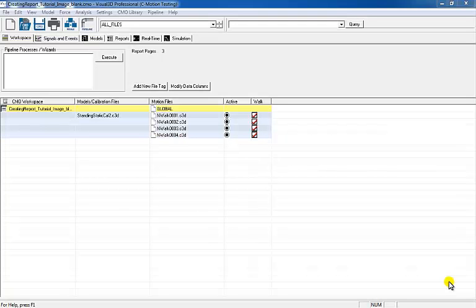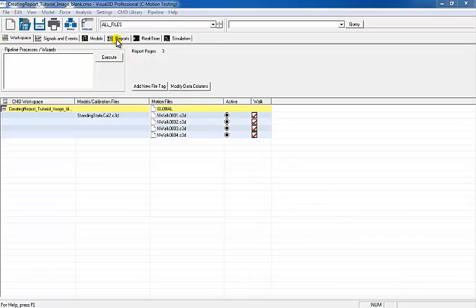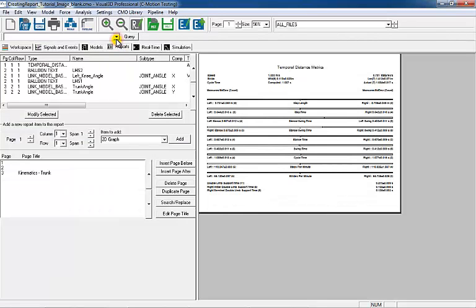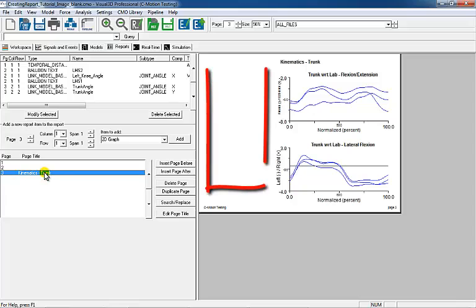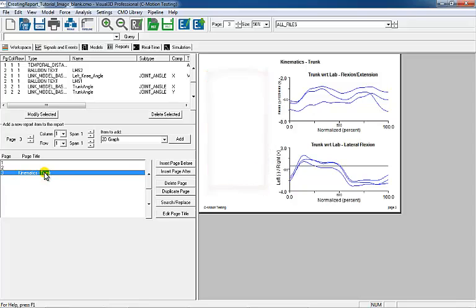By opening the Creating Report Tutorials CMO file, it can be seen that some items have already been added to the report. In this tutorial, two images will be added to page 3 of this report.